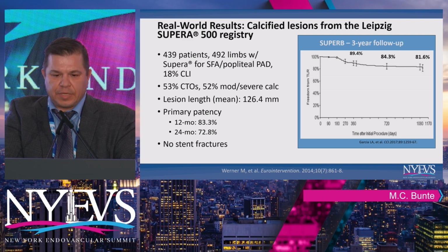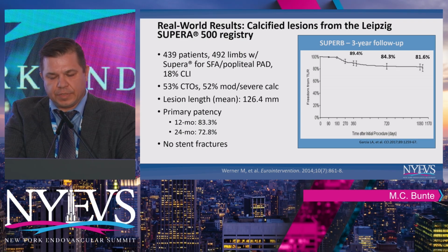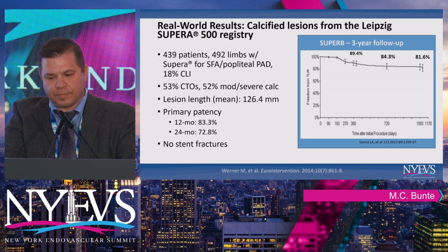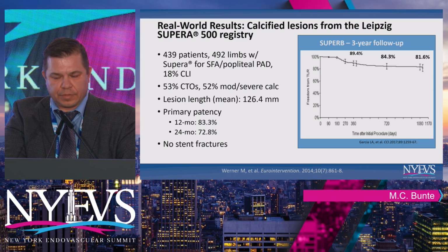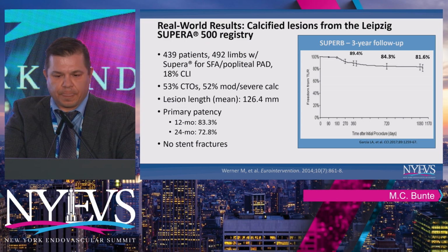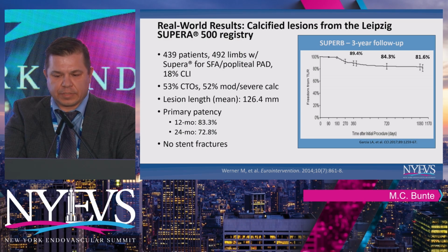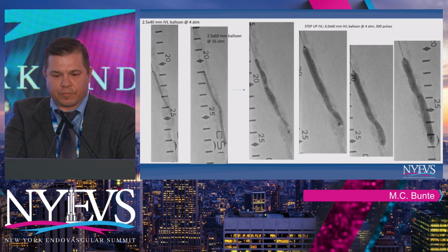Hard to not mention Supera when we're talking about calcified femoropopliteal lesions, being this interwoven nitinol scaffold that has fairly robust outcomes all the way out to 3 years, and certainly an important treatment for complex calcified femoropopliteal disease, and importantly, a very low rate of stent fractures.